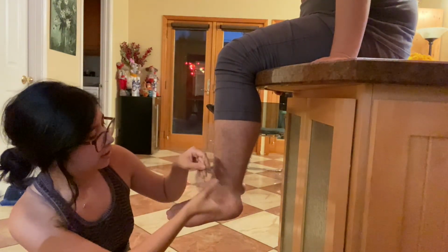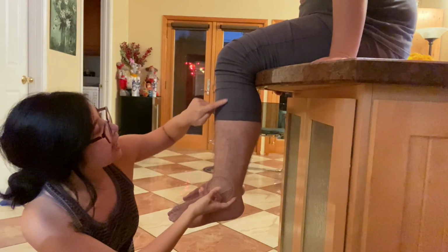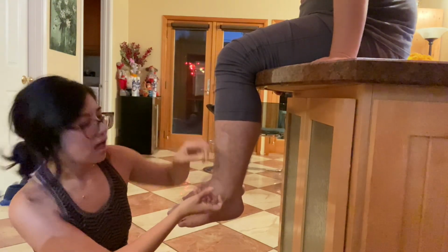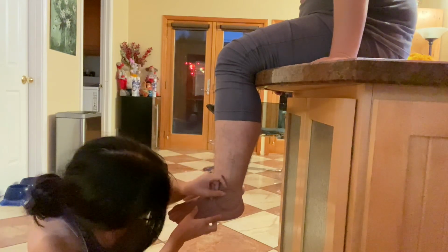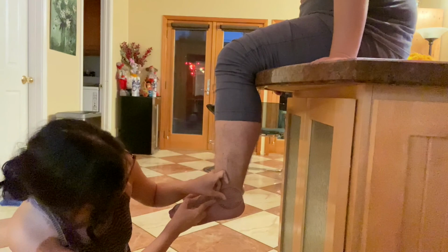The stationary arm is going to be following the lateral midline of the leg, and it's going to align with the fibular head. And then the moving arm is going to be aligned not on the fifth metatarsal, but parallel to the fifth metatarsal.